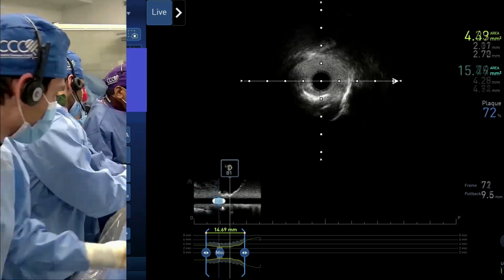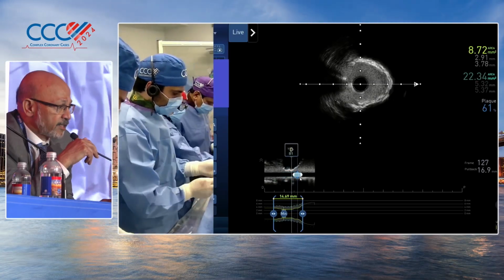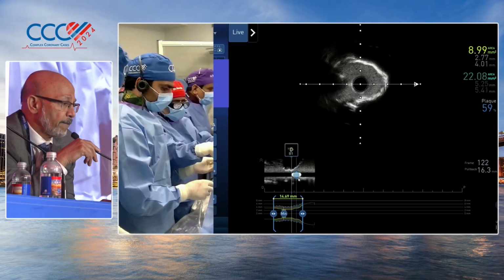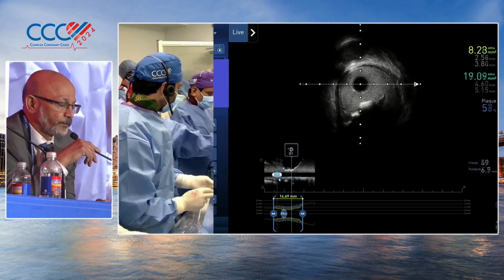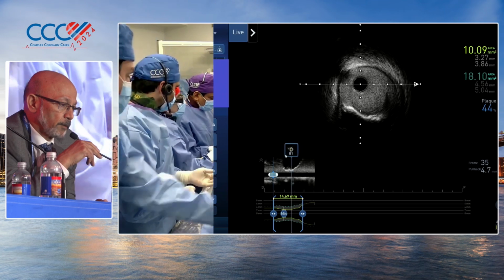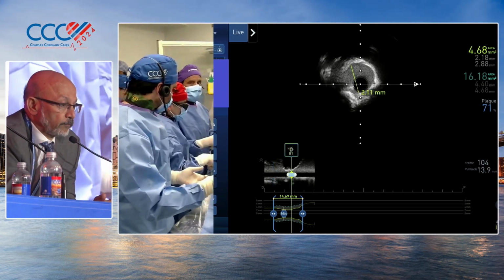If this is after IVL, there's nothing else to do, unless it's a lot. What was the size of the IVL? Is it 4.0, Sami? 4.0, yeah. And with the 4.0, we went up to 6 and then 8. That looks nice. The only thing is, I don't go on the IVL balloon to 8.